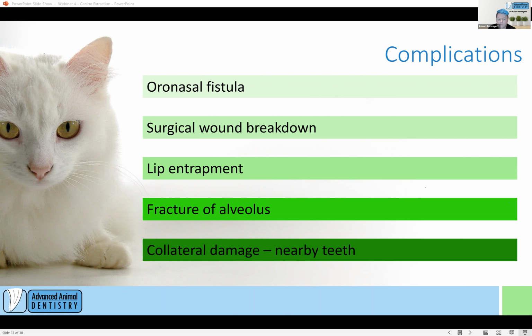The premolar 1, unfortunately, many premolar 1s have suffered at my hands through the years. Again, it's with our rotational force on that distal part of the canine, that force can push, and they usually are somewhat diseased anyway, but it can push on the root tip of premolar 1. They should pop it out.